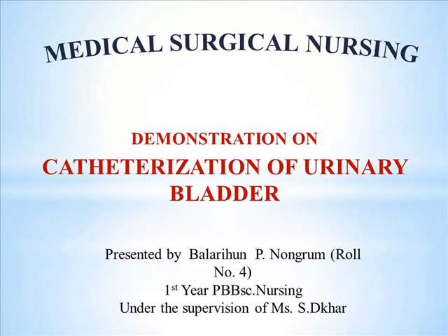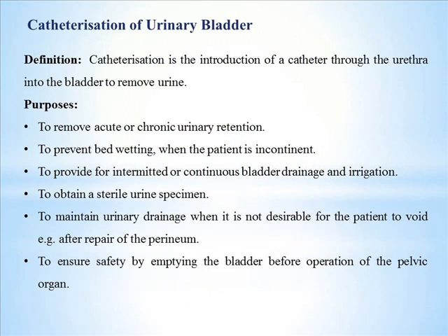Now I'll do a demonstration on catheterization of urinary bladder. First, we'll see the definition of catheterization. Catheterization is the introduction of a catheter through the urethra into the bladder to remove urine.